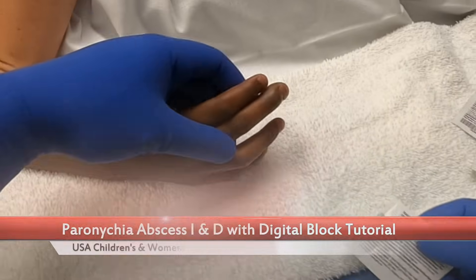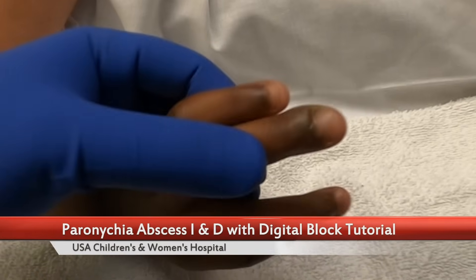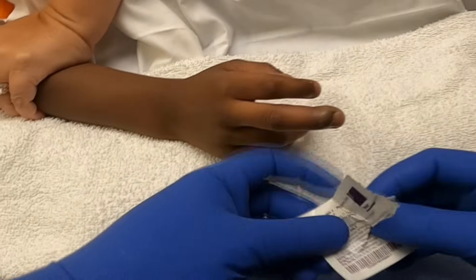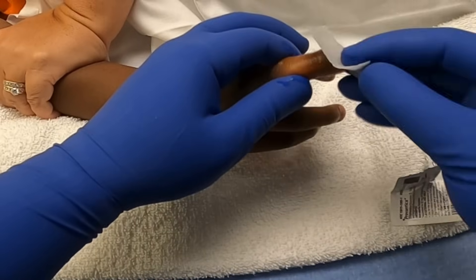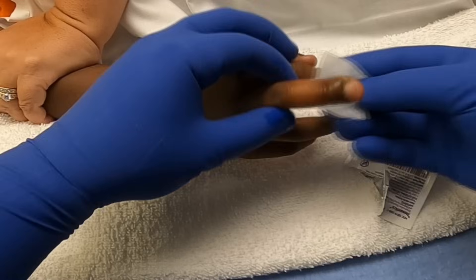We have a paronychia on the right middle finger. We're going to start by cleaning it off with some chlorhexidine. We've already given the patient intranasal versed to facilitate some relaxation and cooperation with the procedure.